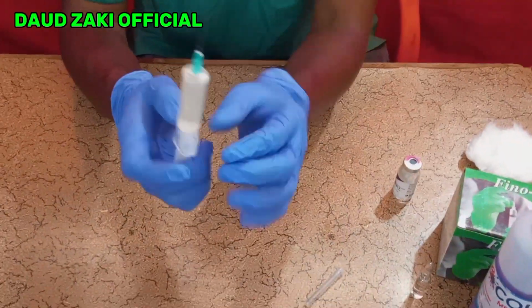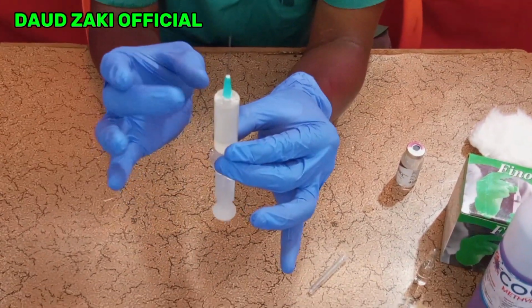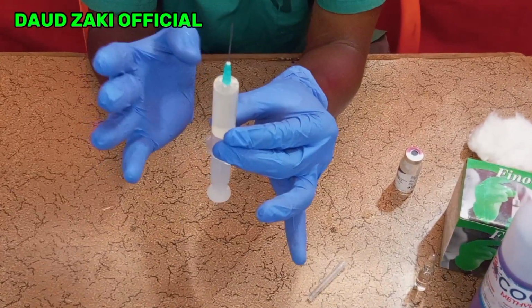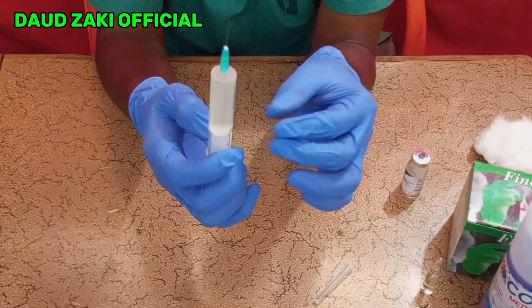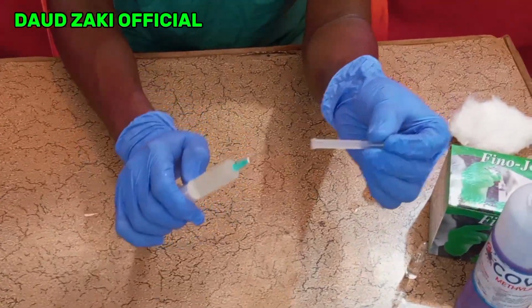After you have withdrawn, you have to pull the plunger and tap the syringe to remove any air bubble before you start administering the drug to the patient. After you have removed all the air bubbles, then you can administer the drug to the patient safely.